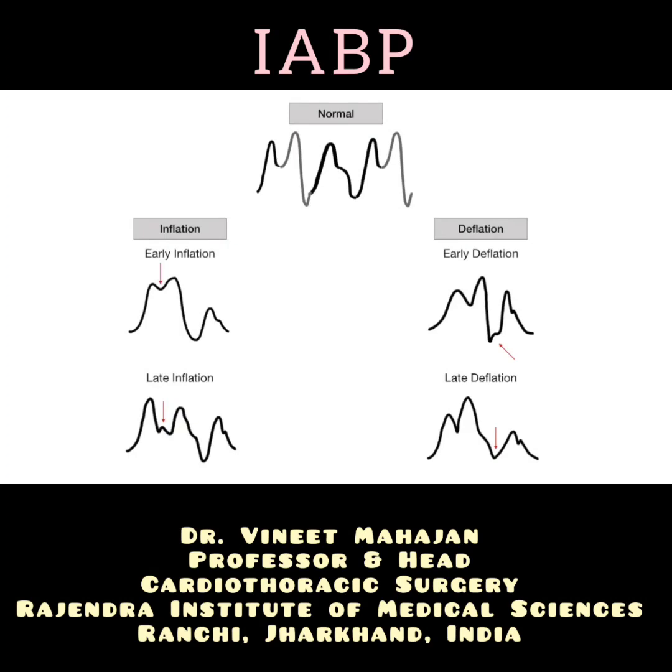There are times when the intra-aortic balloon pump timing is just not right, as evident by an abnormally looking waveform. There are 4 types of timing abnormalities. Early inflation is inflation prior to the dicrotic notch. The aortic valve closes prematurely, inadequate amount of blood leaves the left ventricle, and thus inadequate coronary perfusion occurs. There is also an increase in afterload.